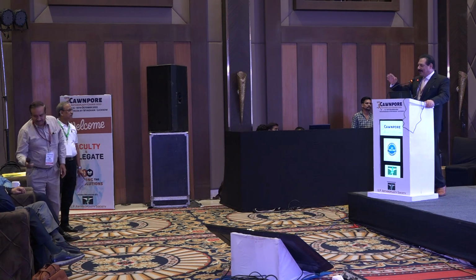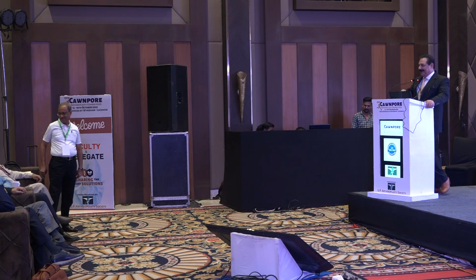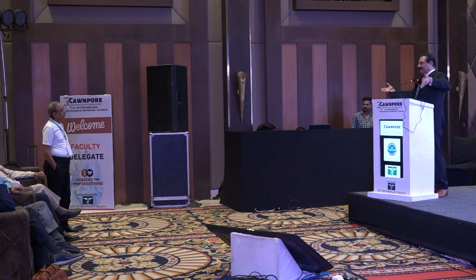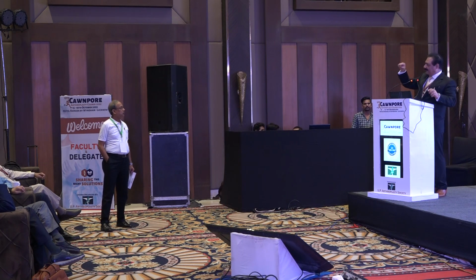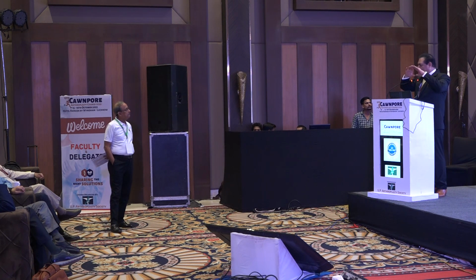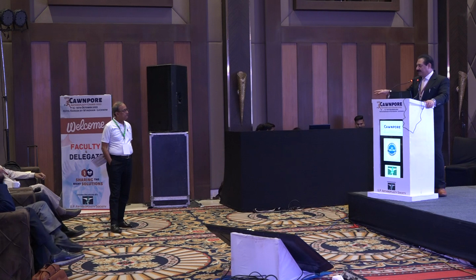See, fortunately, I do all my hips by lateral approach. I don't do posterior approach. Everything is in front of you. I just put a laminar spreader, and I don't use that inferior Hohmann at all because it interferes with closing the cup. It tends to make it vertical. So I've been using lateral. I can't answer this question because I don't use posterior approach at all unless I'm doing a revision and ETO. Otherwise, all patients, even all dysplastic hips, I do by lateral approach.